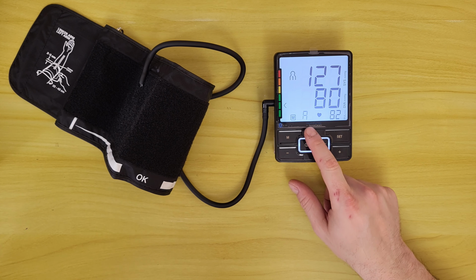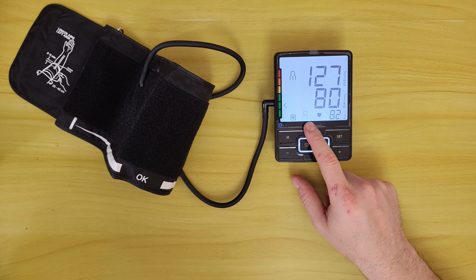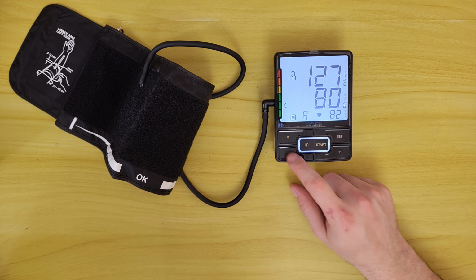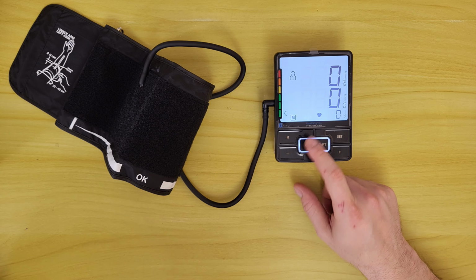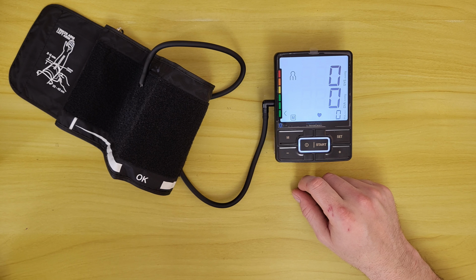Press the M button, we can see we've got the A. A, it is the average value. Press the M button again. Now we've got the AM, it is the morning value. Press the M again, we've got the PM, it is the evening.